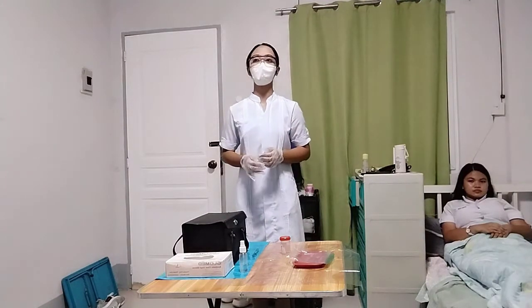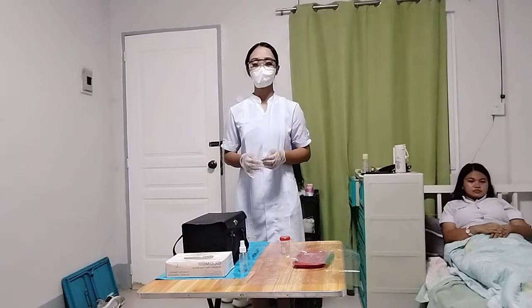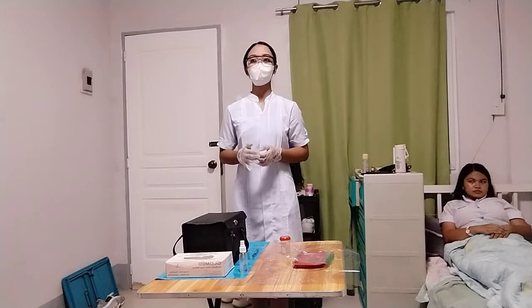If the client produces sputum, open the lid of the container and have the client expectorate the specimen into the container. Follow these special precautions if tuberculosis is suspected when obtaining the specimen. Ask the client to expectorate the sputum into the specimen container and make sure the sputum does not contact the outside of the container. If the outside of the container does become contaminated, wash it with a disinfectant.